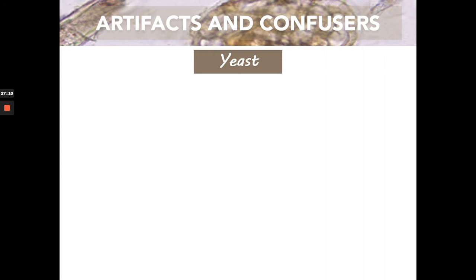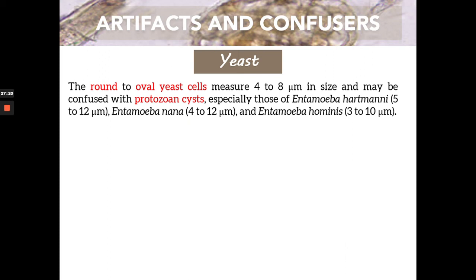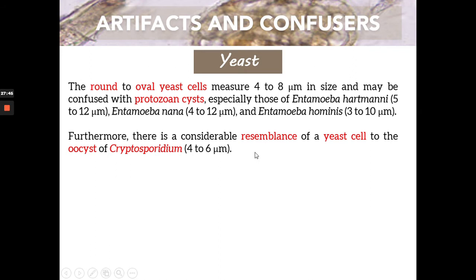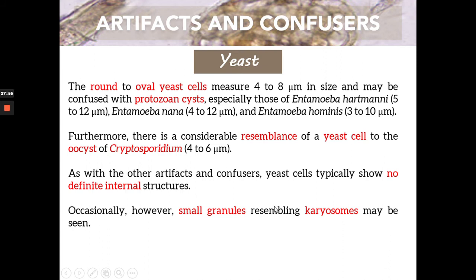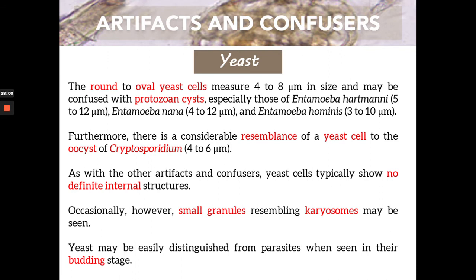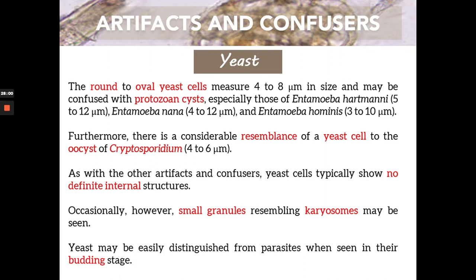Next, yeast cells are another type of microorganism — a type of fungi. Because of their appearance, oval yeast cells can be mistaken as protozoan cysts. The size of your yeast is closely similar to the size of Entamoeba hartmanni, Entamoeba nana, and even Entamoeba hominis. A yeast cell can also resemble the oocyst of Cryptosporidium, as sizes are very close at 4 to 8 micrometers.